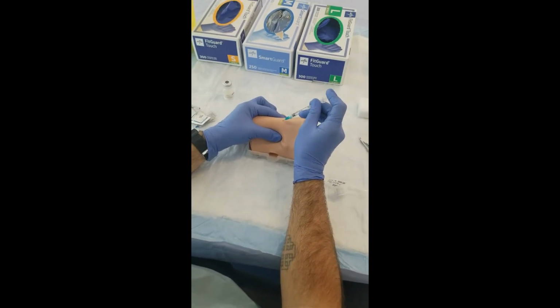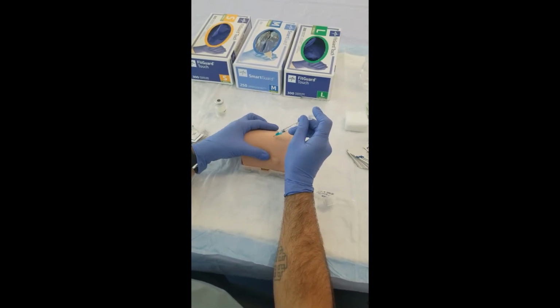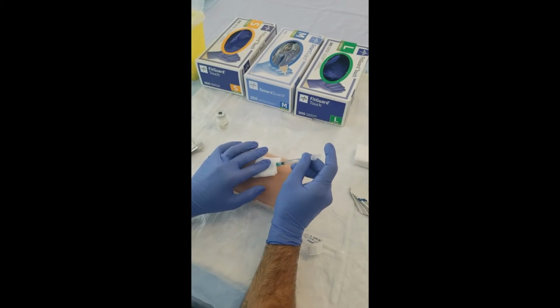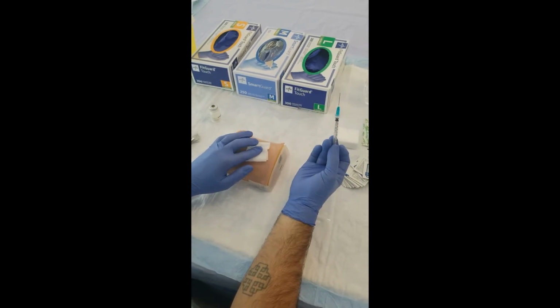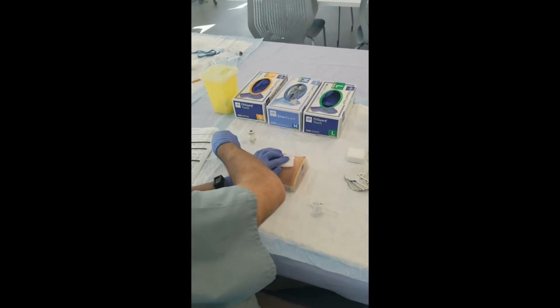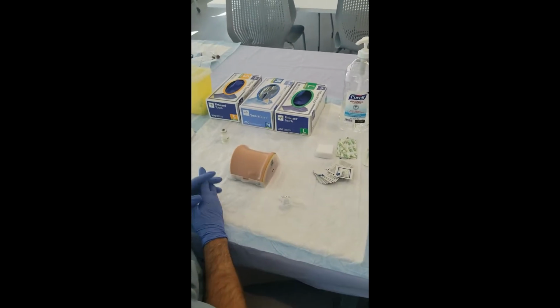Step 25. Removed needle syringe using a 2x2 gauze pad with slight pressure. Items 26 through 29 can be done in any order. Step 26. Disposed of supply safely and appropriately. Step 27.